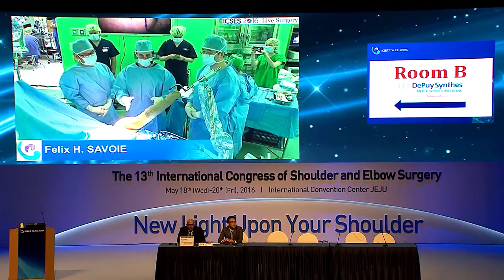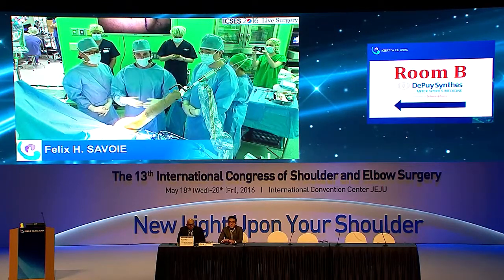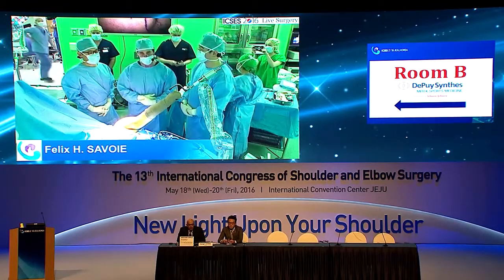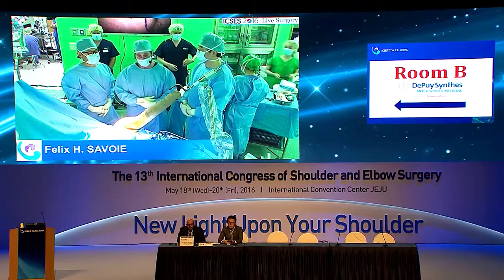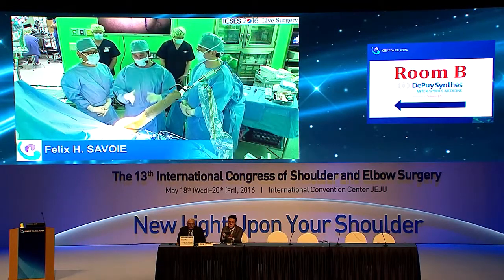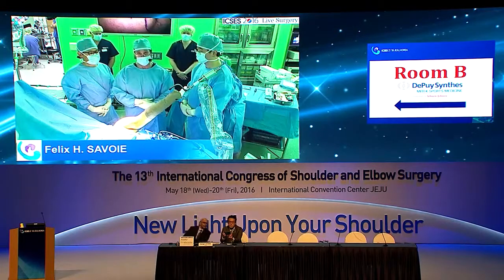The rotation medical patch, there's some other things I can do. I mean, I can do convergent stitches and lots of other things if it fails early. Joe Iannotti has some great work showing that cuffs do fail early, and we go very, very slowly. That's why the 6-week ultrasound, I think, is so important.